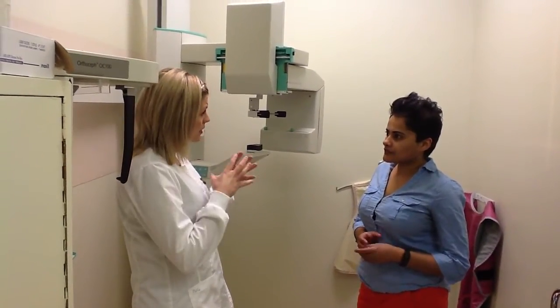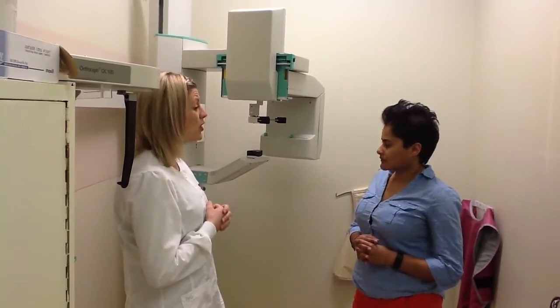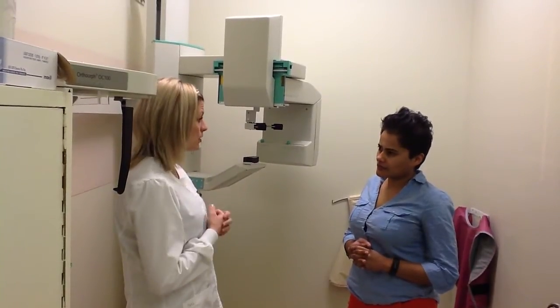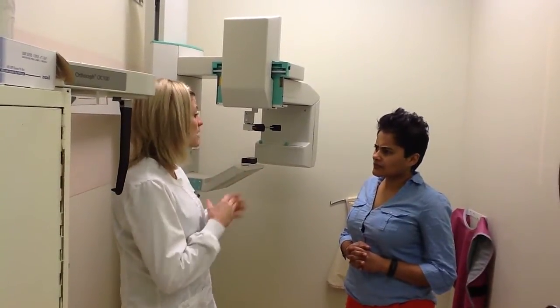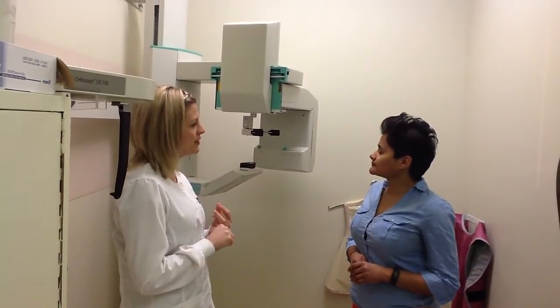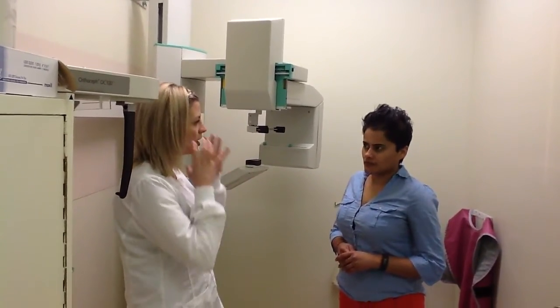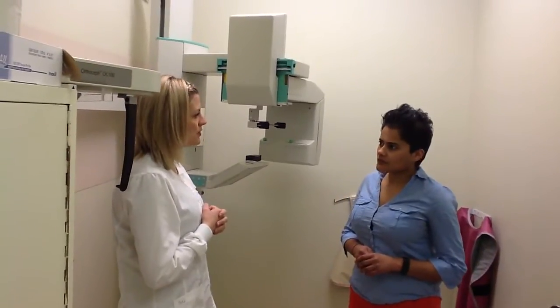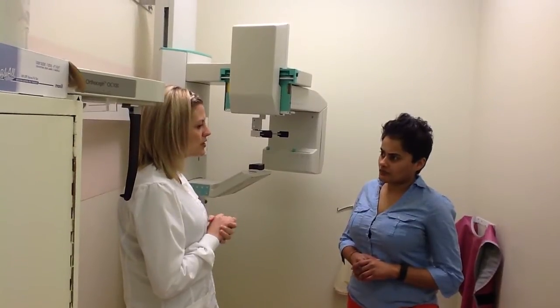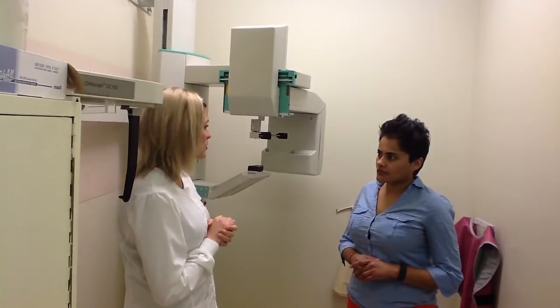A pan will show an image that is around the outside of your head. Okay, we call it extraoral. The bite wings that we just previously took of you is an intraoral exposure. This is an extraoral, so it's outside the patient's... Outside the mouth? Exactly. What it's going to show is all of our teeth. We're going to have our crowns of our teeth, our roots of our teeth. We're going to show all bones supporting our teeth, our jawbone, and our joint. We use it for diagnostic purposes, looking for any abnormalities, and also as a baseline for any younger patients. We can see our wisdom teeth and everything in action, so it's very useful.